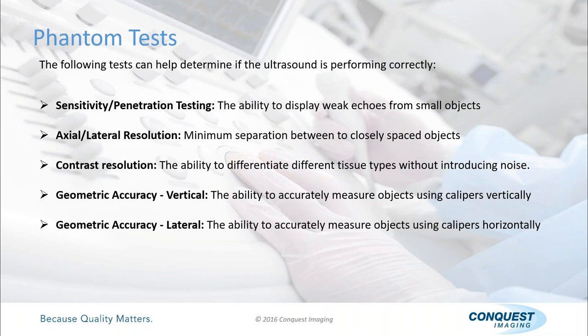These are the small objects, and those are the ones we use to measure penetration, the very smallest objects here. And people often ask, why would you use the smallest object? Well, when do you want to recognize a tumor or cyst? When it's small, right? So that's the way they design it to test it, so we can come up with a realistic measurement for how deep the probe will penetrate at its multiple frequencies. Then you record the maximum penetration capability for that probe. And you might think the maximum penetration capability for that probe would be at its lowest frequency, correct?